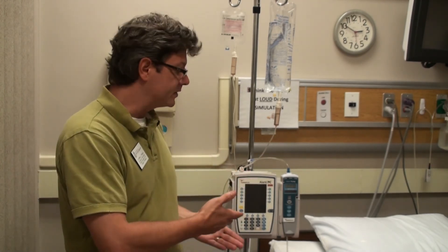This is the Alaris pump — you'll be using a lot of it. Please feel free to come in at any time, ask us for help, get your hands on it, and learn how to use it. That way you won't be frustrated when you get into a scenario trying to figure out how to operate the pump.